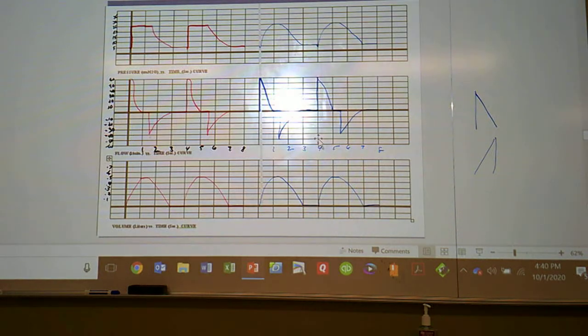All those volume ones look the same pretty much almost. Yeah, volume is boring, unless you got auto-PEEP or something like that. Volume is a pretty boring tracing. That's why on the 840, I only have pressure and flow usually. I don't even look at volume. I mean, there's information you can get from it, but it's not as sexy.